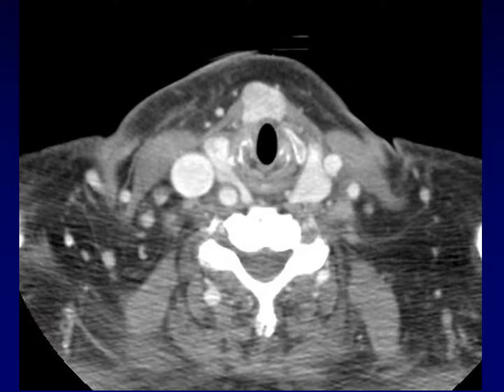In addition to thyroglossal duct cysts, you can get remnants of functional thyroid tissue anywhere along the thyroglossal duct. Here is functional thyroid tissue embedded within the strap muscles, just where you'd expect to see a thyroglossal duct cyst, but this is thyroid tissue. We can call these thyroglossal duct anomalies as a more generic term.